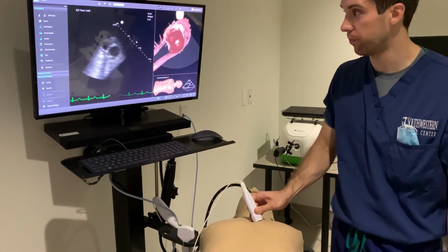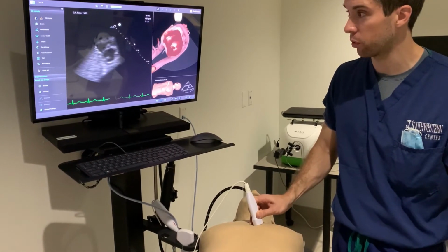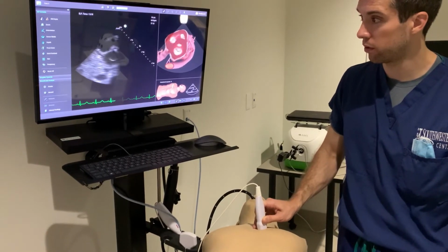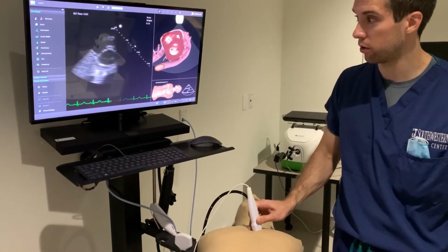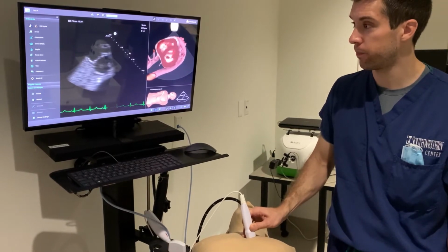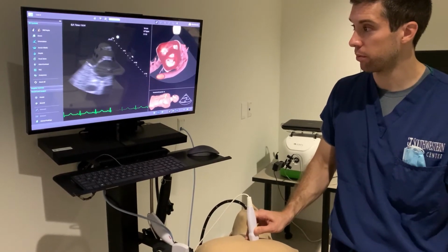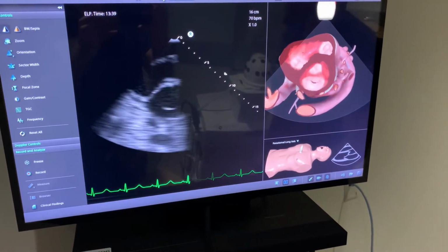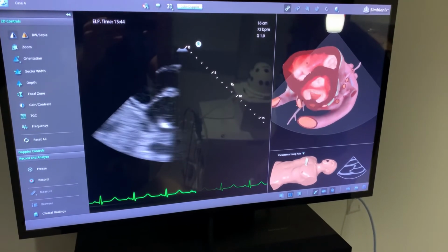Yeah, exactly. And then if I want to, I can tilt or fan back up towards the mid portion of the left ventricle and right ventricle. So here at the mid-papillary level, which we had seen previously, the interventricular septum is muscular, and so you get a good sense of the function and wall motion if that's necessary for you. And then he's going to keep going up to the mitral valve. So that's the fish mouth view of the mitral valve that we had seen, looking for mitral valve pathology. Keep going up.